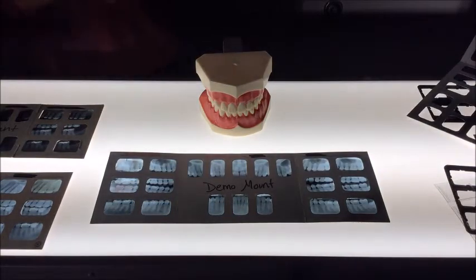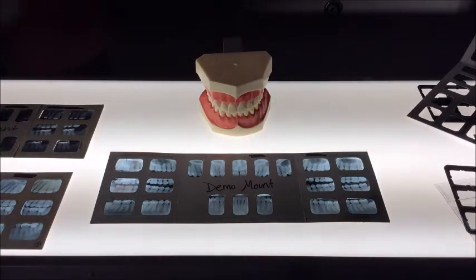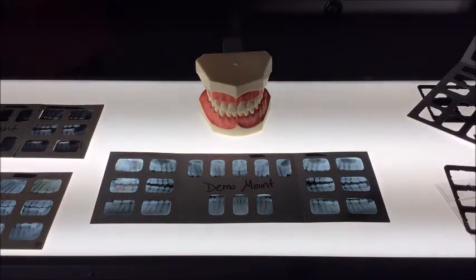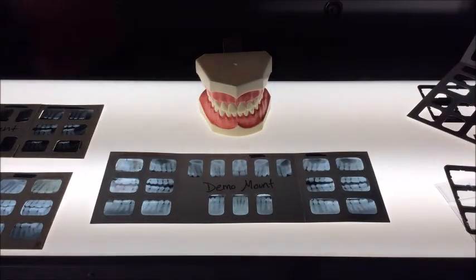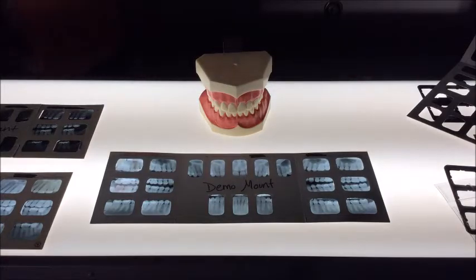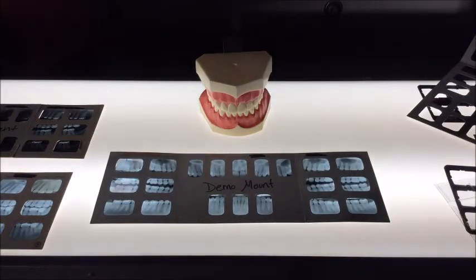And it also helps when viewing films side by side. It allows for easier comparison between different views. Many times, with films that are in a film mount, it's easier for the provider to provide consults and patient education, which is definitely enhanced by having films in a proper mount. Film mounts provide a means for labeling the radiographs with the patient's name, date of exposure, name of practice, and provider. Film mounting is utilized for intraoral films.